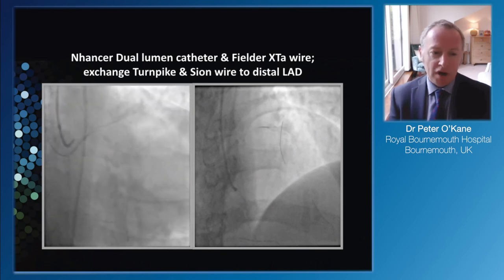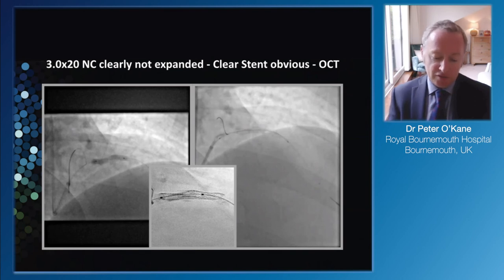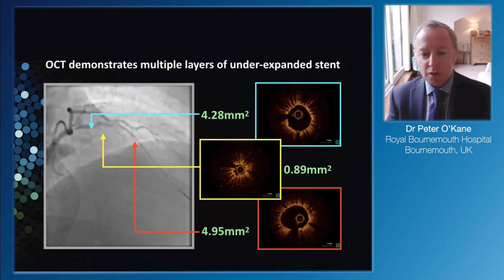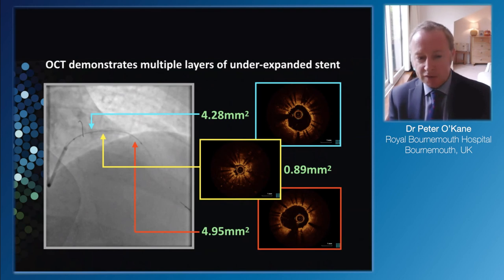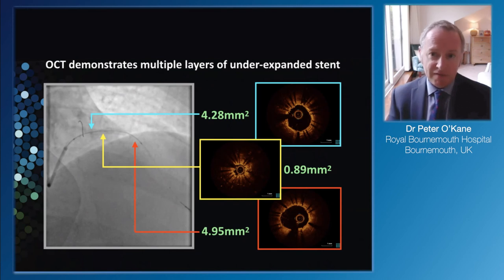I used a dual lumen catheter to make sure we got down through the stents quite safely. When you balloon up, you can see on the ClearStent technology a very obvious, very under-expanded stent. Having opened things up, I thought the best technique to understand what's going on would be OCT. On the OCT images: distally there's a lumen of about 4.95mm² in the red box, proximally about 4.28mm² in the blue box. But at the lesion point the lumen area is 0.89mm², with the catheter almost being gripped by the stent. There is definitely more than one layer of stent - possibly two, three, maybe even four layers of stent in this one particular spot. So a very extreme case.